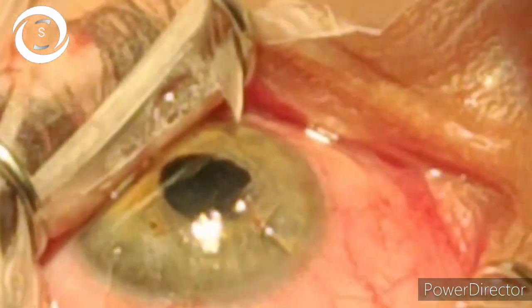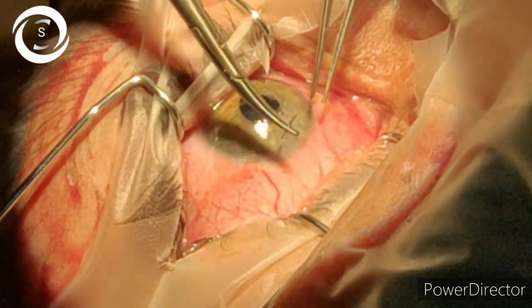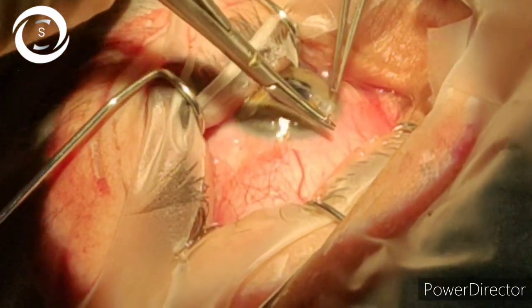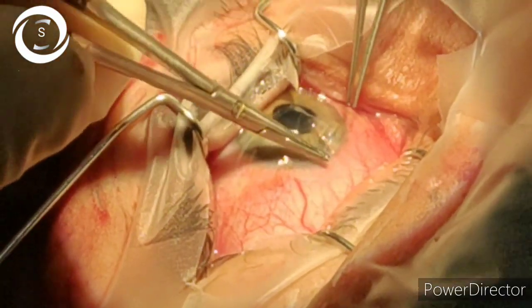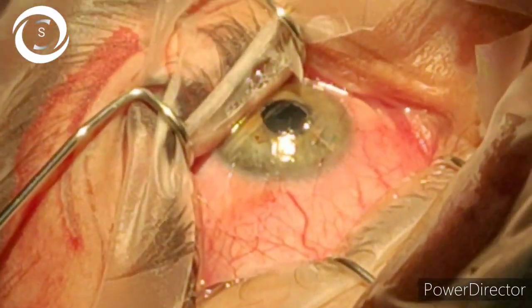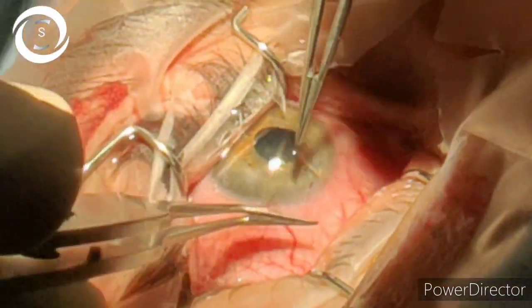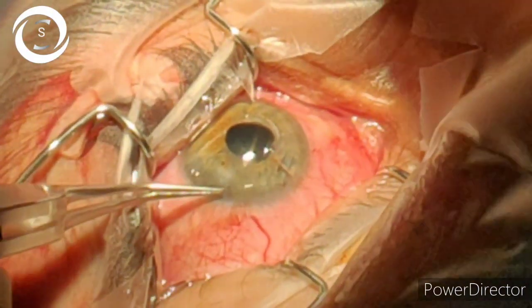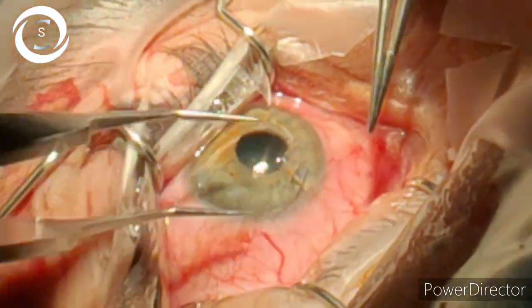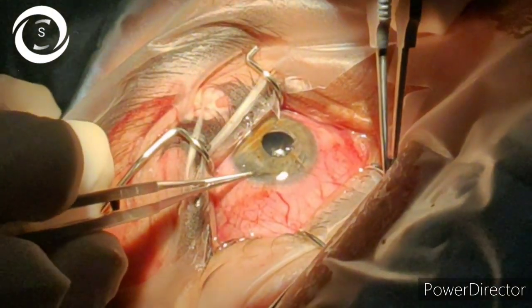After the first successful horizontal suture, anatomical landmarks became clear and easily identifiable, making the next suture easier to perform. You can see we have performed the first suture and are now about to start the second horizontal suture. You should be very clear that you are going through partial-thickness cornea and not taking the iris. The viscoelastic has exited the eye and the anterior chamber has become shallow, so there are chances of taking an iris bite along with the suture. I made sure to go deep into the corneal stroma and avoid iris incarceration.